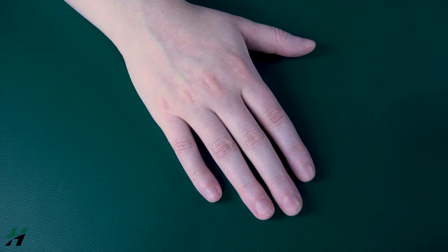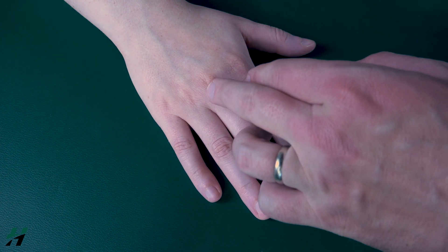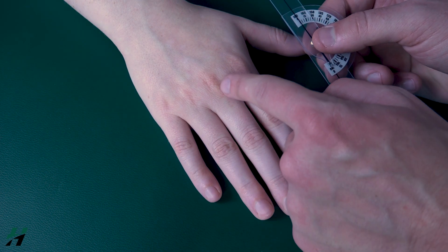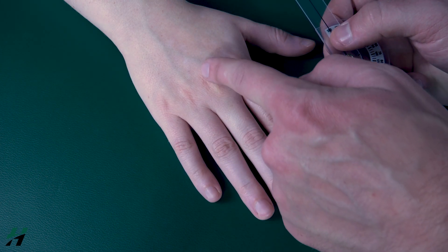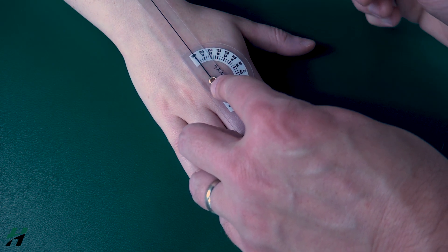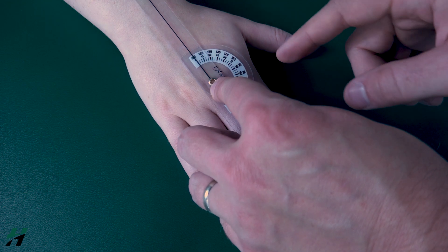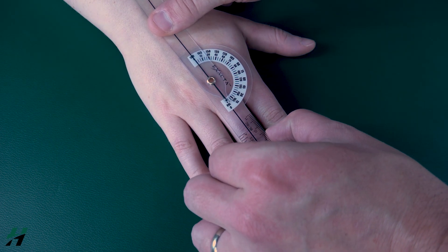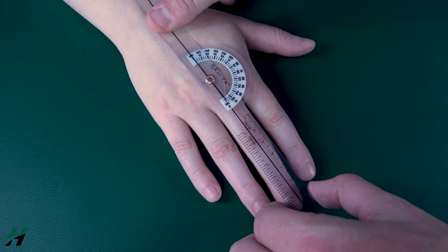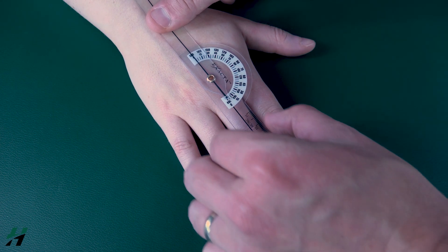Measuring MCP abduction: the patient's hand will be on a flat surface. The goniometer axis will be directly over the desired MCP joint — in this case the third MCP. The stationary arm goes over the desired metacarpal, which is the third metacarpal, and the movement arm over the proximal phalanx. Make sure you align the movement arm with the proximal phalanx rather than the fingernail or distal phalanx, as those will give you very different measurements.